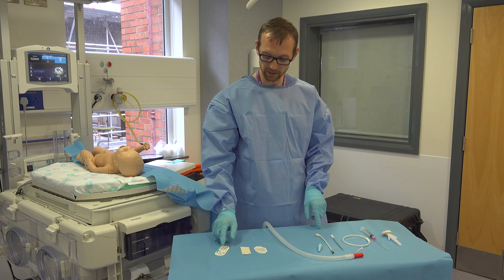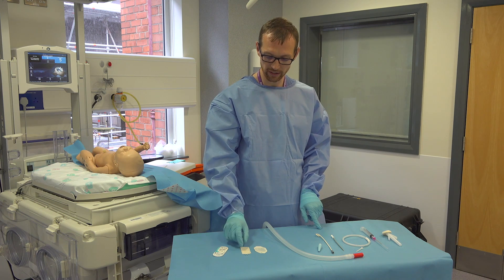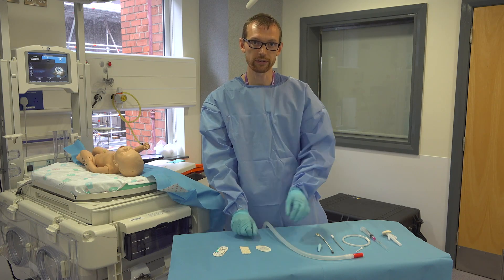For securing, we would normally put a suture in the skin, wrap it round the drain, and then steri-strip to the skin with tegaderm on the top.